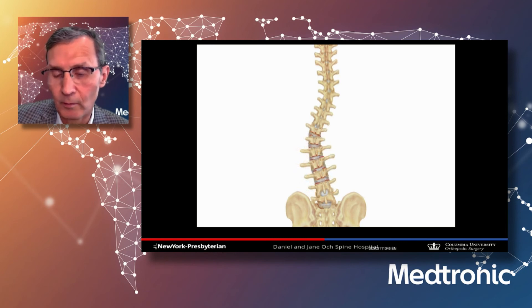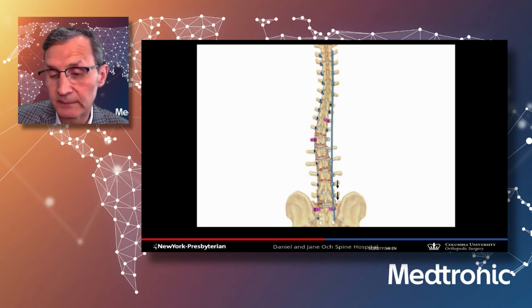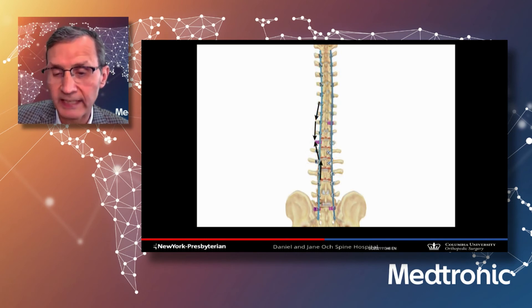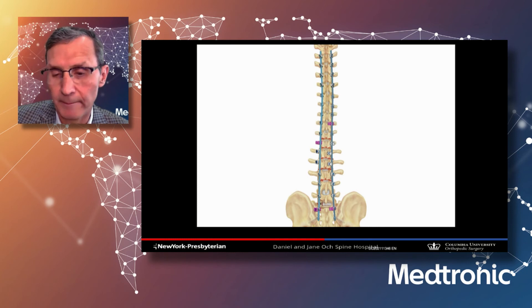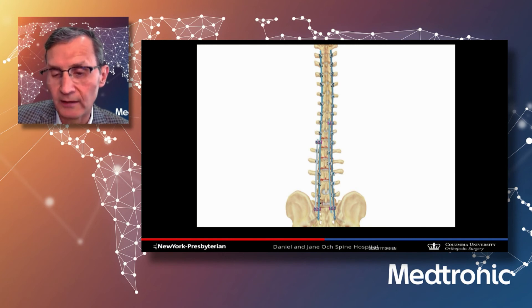The video shows a double major curve with releases and interbody fusions providing some spontaneous correction. The right-sided rod is applied distally first; I compress L5-S1 and L4-L5, which horizontalizes the spine in the coronal plane and produces slight lordosis in the sagittal plane. The left-sided rod is attached to the S2AI screw, the dual-headed S1 screw, distracting that rod, then compressing the apex of the lumbar junction and attaching the rod all the way up. The third rod goes on the concavity of the lumbar curve using reduction screws to pull the apex.